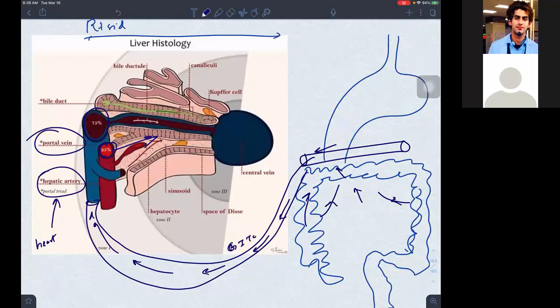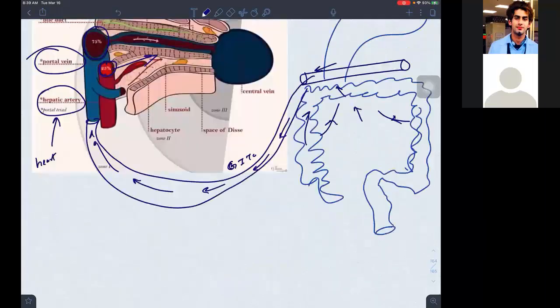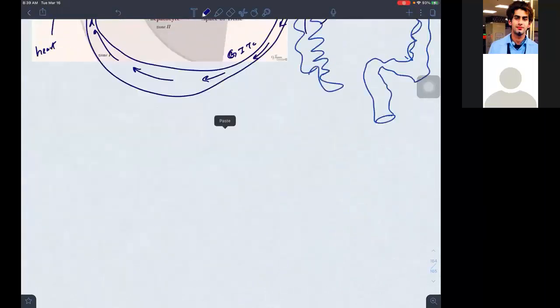Okay, that's beautiful. You have understood at least this first concept, which is always confusing people. So in the liver structure, we are able to appreciate some. Let us first paste it here.